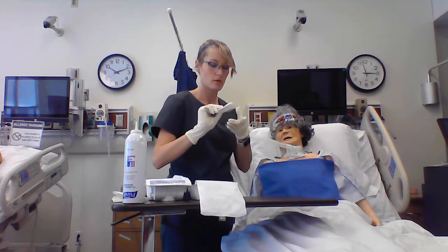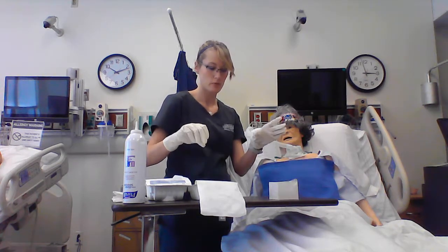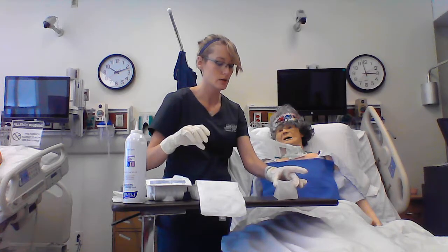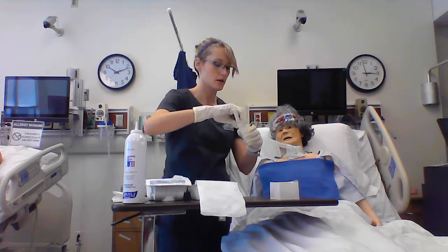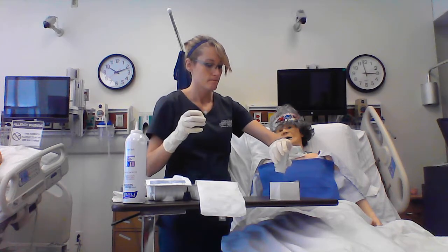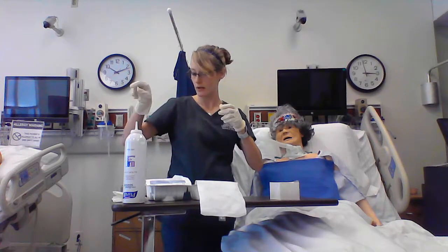Pull out your cup for normal saline. You should have a cup of sterile normal saline in your kit. So go ahead and pour that in. And throw that container away.